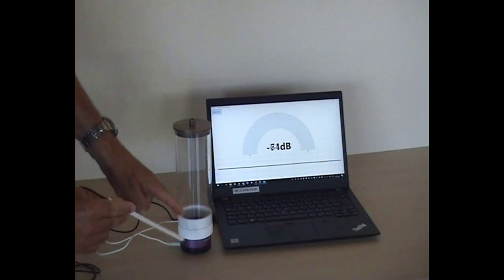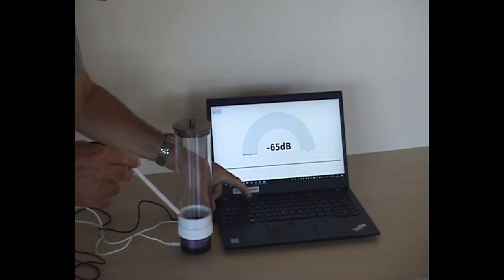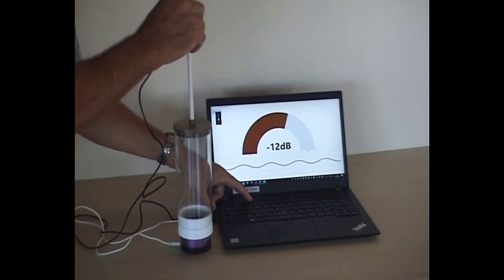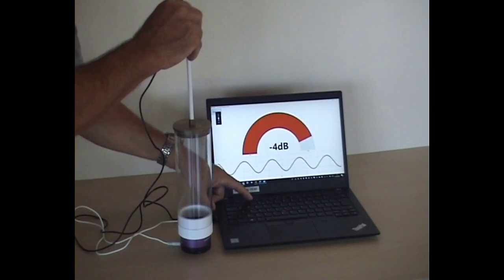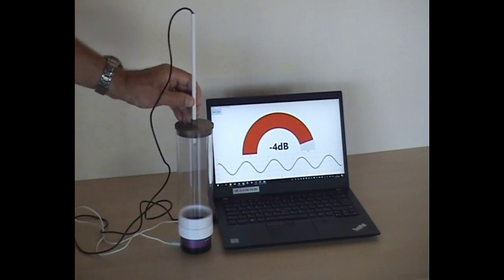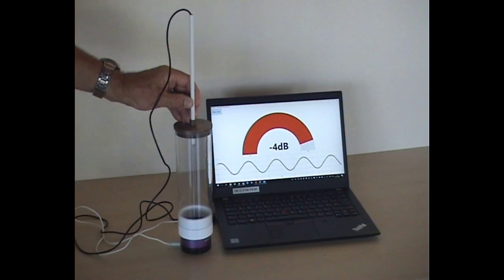But it allows us to explore the sound field now inside the ear canal with an eardrum in place. Okay, and you can see there we are. The microphone is right at the eardrum now, the tympanic membrane, and we've got a nice loud sound that's been produced, propagated down the ear canal from the probe loudspeaker.